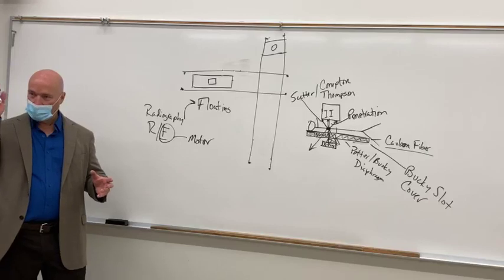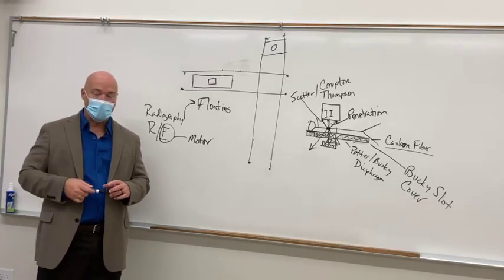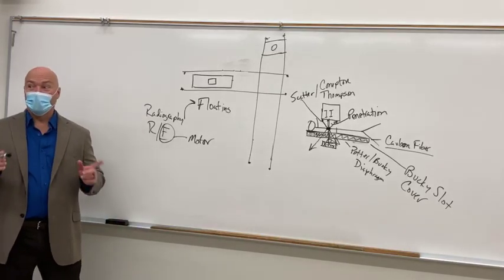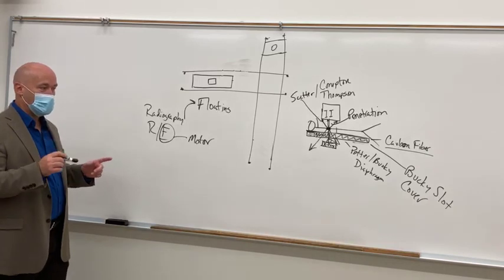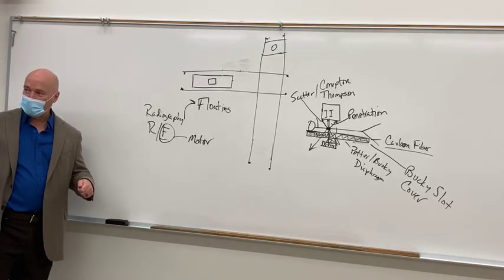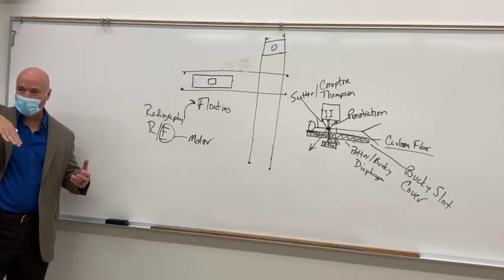So that if you have to put the patient in a standing position, or has anybody done a cervical myelogram yet? No? Cervical myelogram, they inject a contrast and then they strap the patient's feet into that footboard and then lower the patient's head.